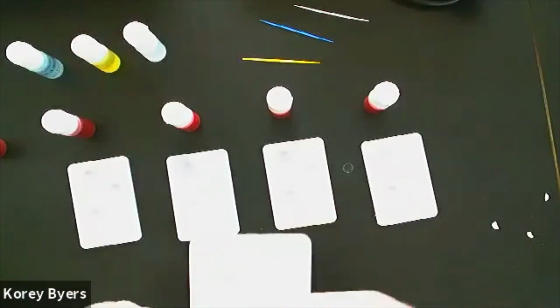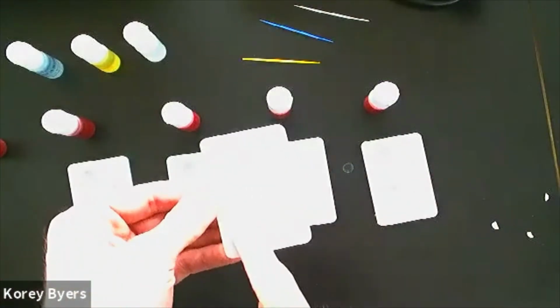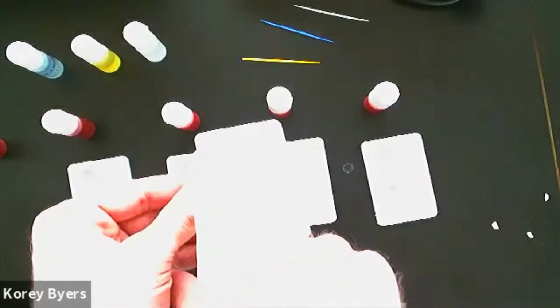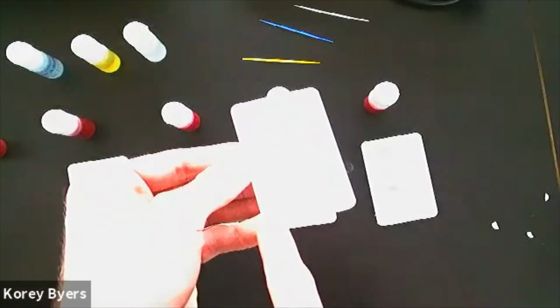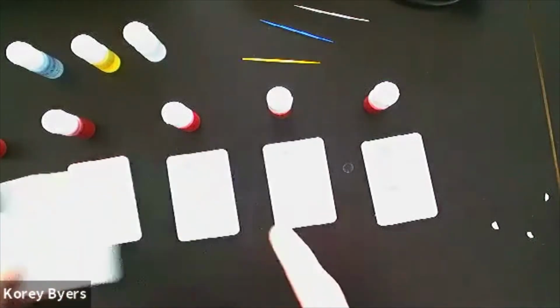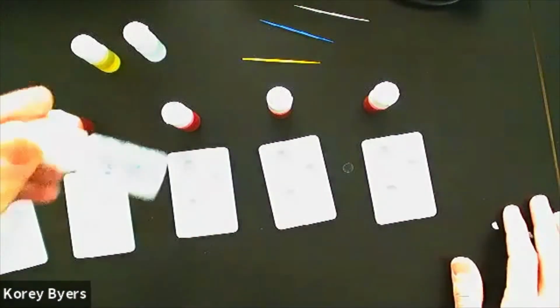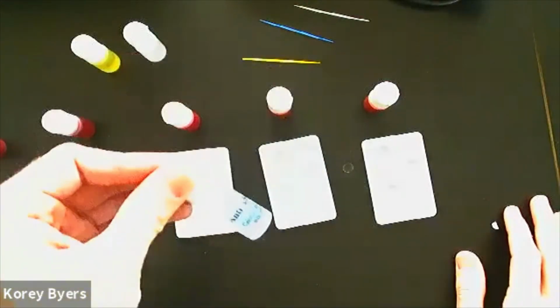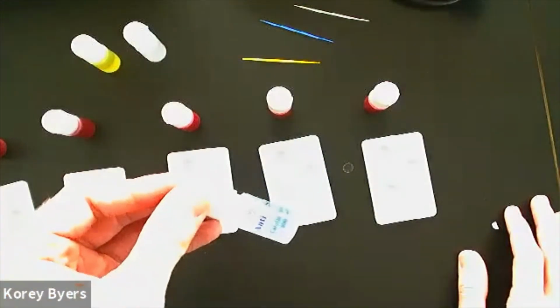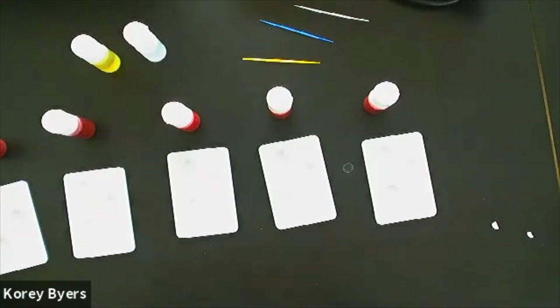If you look at these trays, like you can't see it on my projector, but there will be 3 wells, and each well is labeled A, RH, or B. A is at the top, B is at the bottom, and RH is over here. We're going to figure out what blood types we're dealing with. If an antibody touches that blood type, it's going to clot. So if I have anti-A and it touches a type A blood, it's going to clot. Now our clots are going to look different. Some will be really chunky, some will just be a little liquidy with little dots in it.